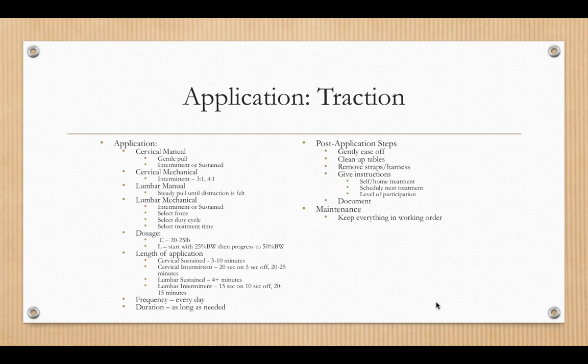Lumbar sustained, 4 minutes plus. Some people will lay on that table for 40 minutes. Intermittent, 15 seconds on, 10 seconds off, 30 on, 10 seconds off, somewhere in there. Maybe about 20 to 15 minutes of treatment. It just kind of depends.